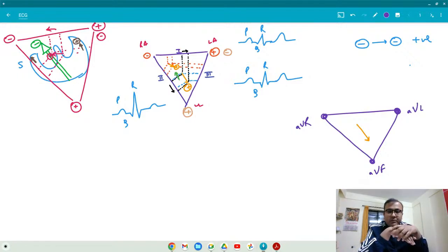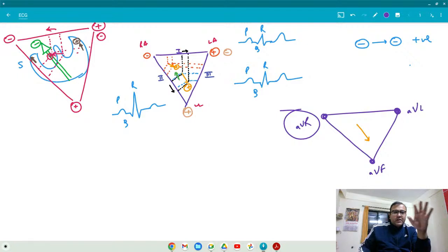So think about AVR. Where is the observer? Here is the observer. Keep it very simple. Think you are the observer. You are standing at AVR. So you think in this way, I'm helping you. This will make your job easier.